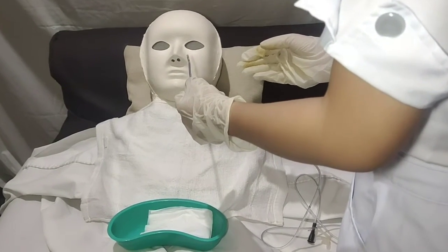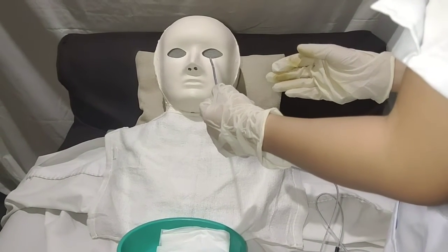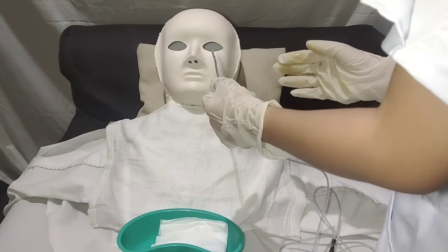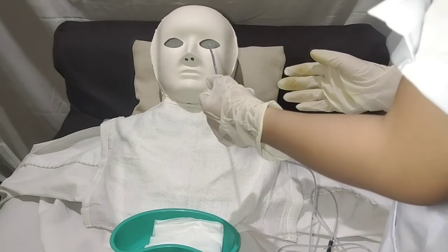Gently insert the tube into the nostril while directing the tube upward and backward along the floor of the nose. Patient may gulp when tube reaches the pharynx. Provide tissues for tearing or watering of eyes. Offer comfort and reassurance for the patient.